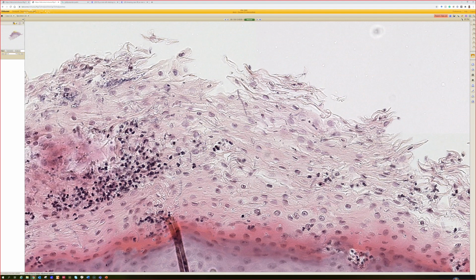How do you know if it's a true hypha or a pseudohypha? I don't know. There is no answer. I'll tell you the answer I use. If I want it to be Candida, then I say, oh, it's a pseudohyphae. If I want it to be something else, I say, oh, they're true hyphae. That's the honest truth. I do not think morphologically that the hyphal structure itself is different, or that I can tell, oh, it's a pseudohyphae rather than true hyphae.